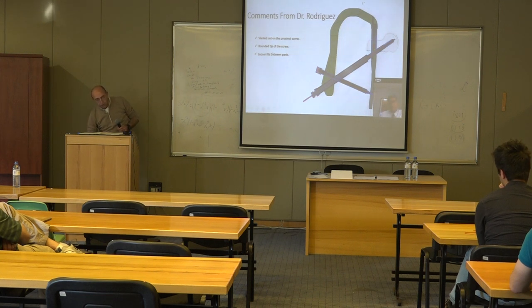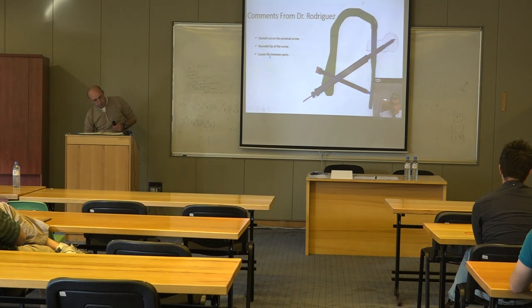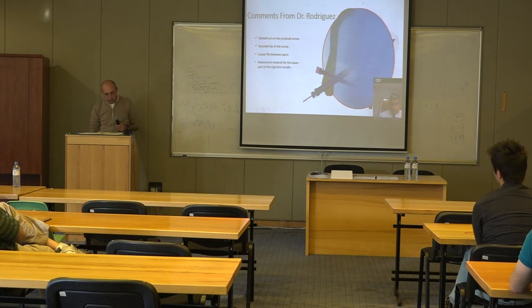And then this comes from my experience as a mechanical engineer in the field of machine tool design. I defined very close fits. Actually, here the comment was that they don't need close fits, that they need looser fits, which is better, which is less expensive from the production point of view.